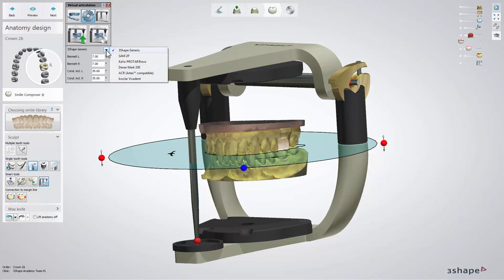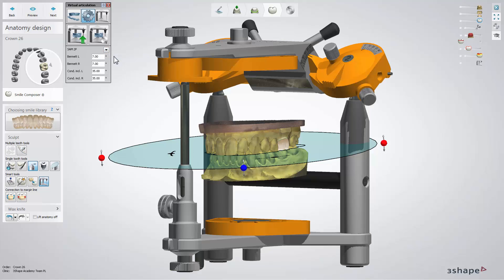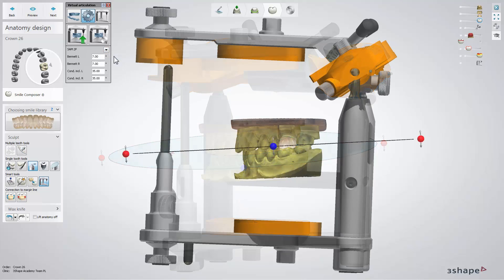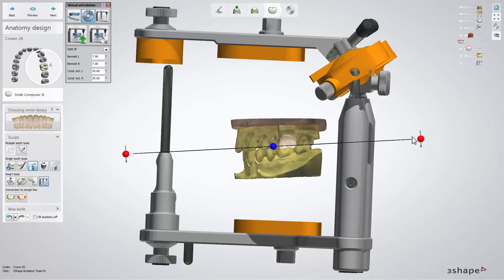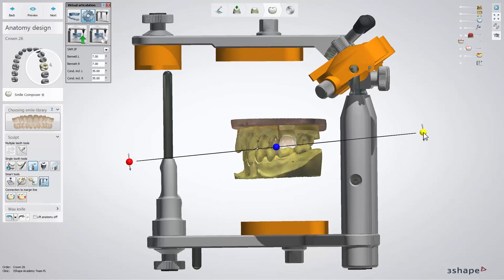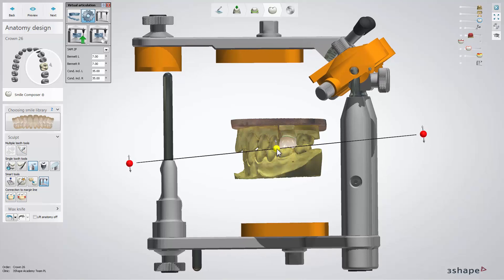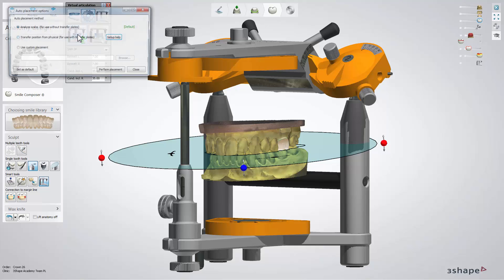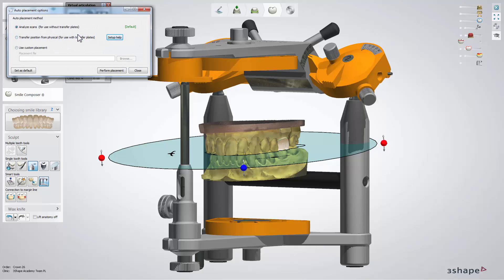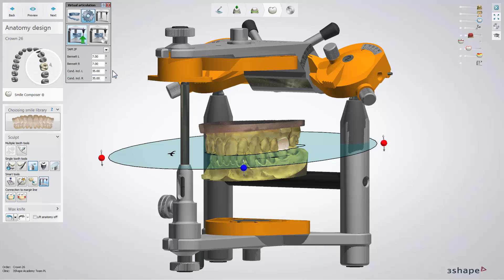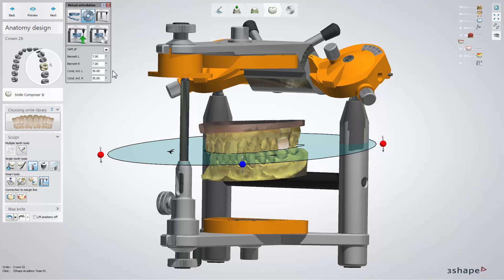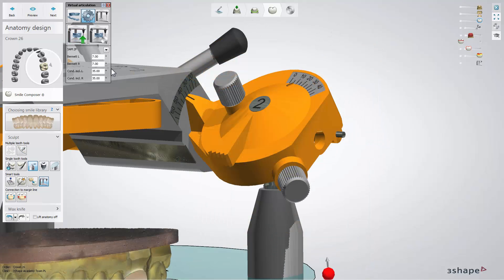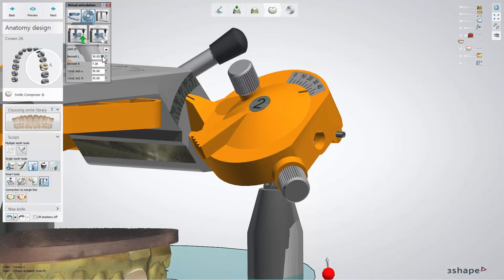Select one of the six supported articulators from the drop-down menu. The position of the occlusal plane can be adjusted with the help of the indicated control points. The auto-placement button helps you set the occlusal plane according to a default auto-placement method. You can specify the articulator settings by changing values of the angles.